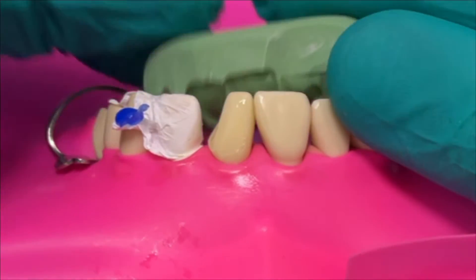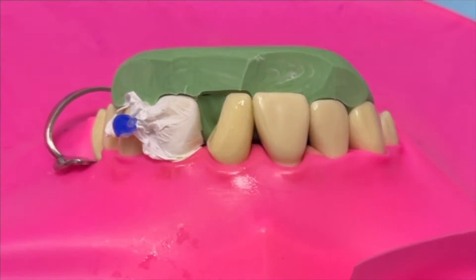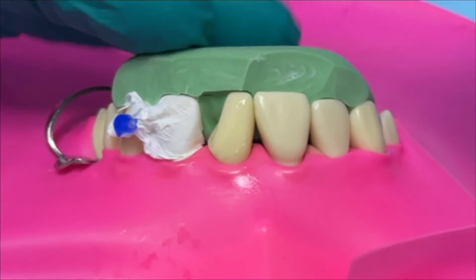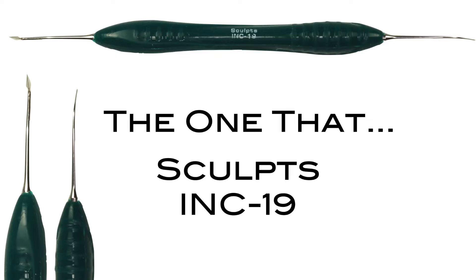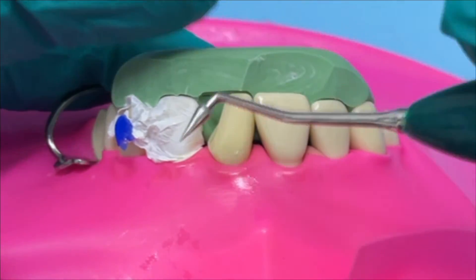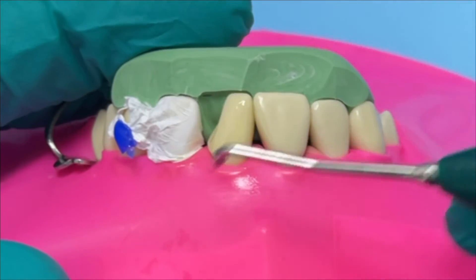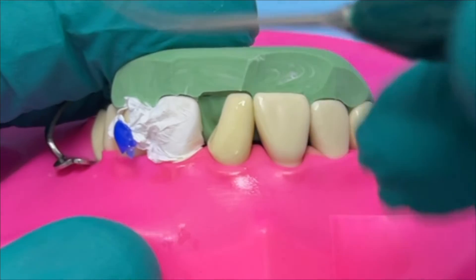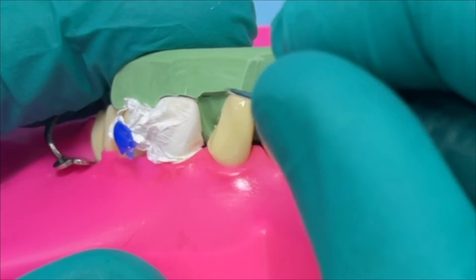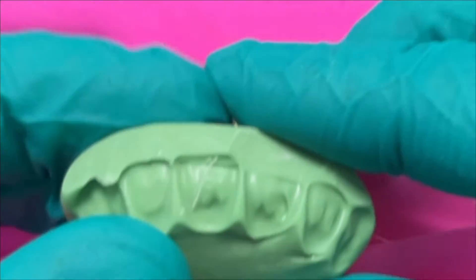Here we're going to demonstrate the putty index technique - imagine this putty was made on a wax-up or the pre-op situation before the cavity was cut. The next thing is to mark where we need to add the palatal shell, and the instrument we're going to use is the one that sculpts. This is one of the most used instruments I have. One end is a very fine, slightly curved sharp probe, and the other is a thicker probe which is good for removing liquid posteriorly. It's also good for shaping anatomy both posteriorly and anteriorly. There's probably nothing better than this instrument for scoring the putty where you want the palatal layer to be added.